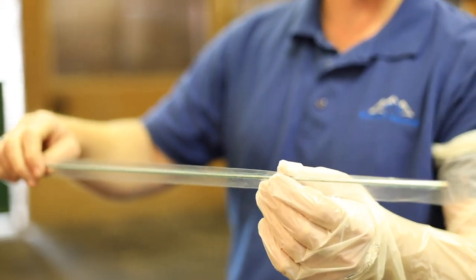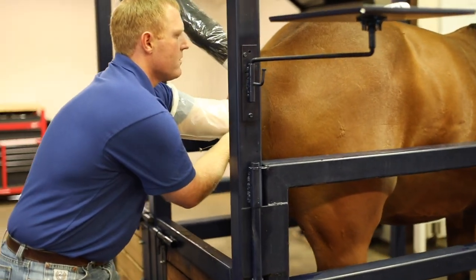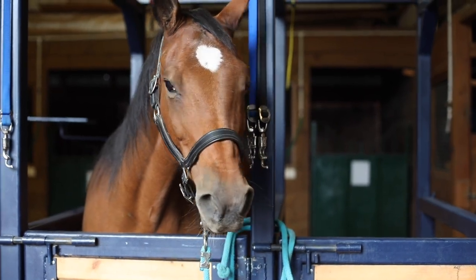This process is very similar to how we would transfer a traditional in vivo produced embryo, as though we bred and flushed and recovered an embryo from a mare. With this technique we pass a casu gun through the vaginal vault, through the cervix, up into the uterus. We then go in rectally and guide that casu gun towards the tip of one uterine horn and gently deposit that embryo. We'll be able to do a pregnancy exam on this mare in the next four to seven days to determine if she's in foal.